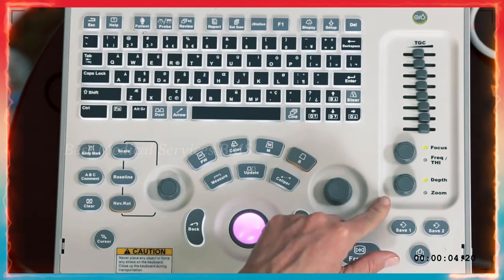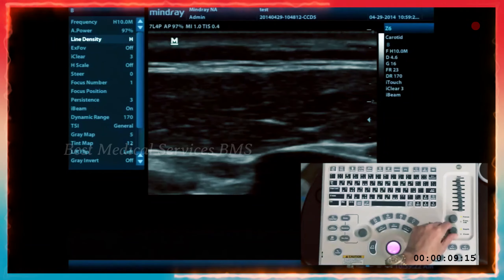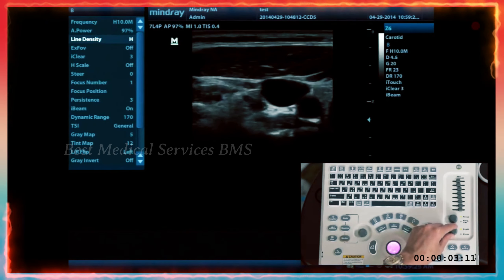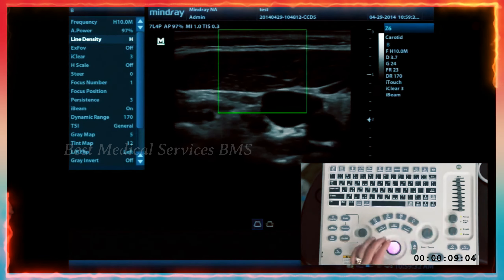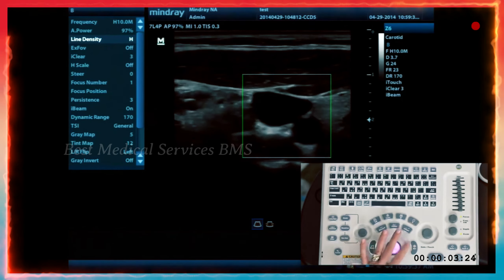Just below that knob is the second knob for depth and zoom. You'll obviously use depth more often than zoom. As you turn it, you can see depth in centimeters adjusting on the right side. If you press the knob, you go to zoom and it'll give you a box. You can move that box with the trackball to position your zoom area, and use the set key to change the size of your zoom box.